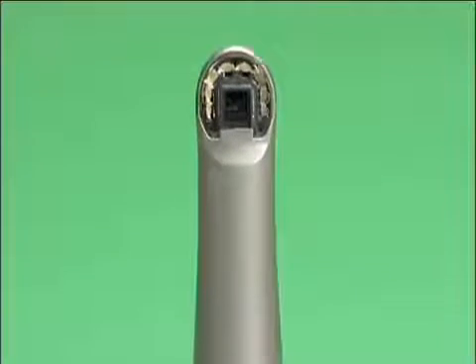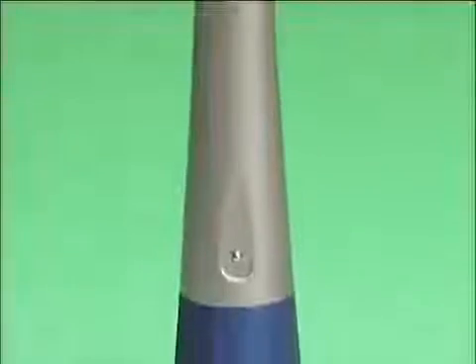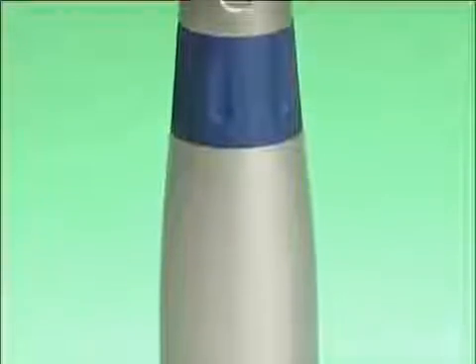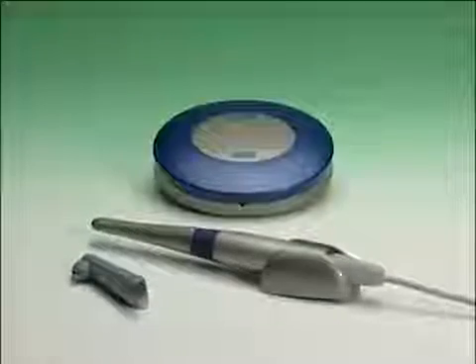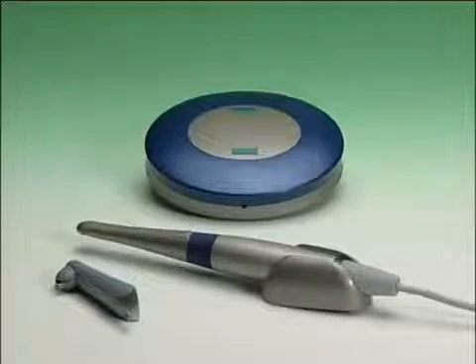The second quality of the Sopro intraoral camera and of the Sopro shade concept is its optical quality that even provides a greater resolving power in terms of hue. The advantage is also to make the shade selection on a screen, and it's much easier due to the camera's enlargement power. The Sopro camera is an excellent communication tool for working with the prosthesis lab.